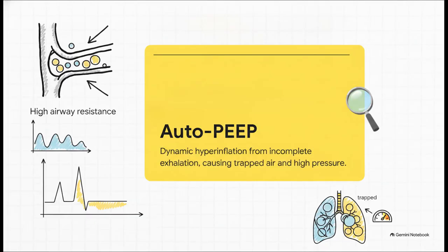And that case really highlights exactly why understanding the underlying disease is so vital. In obstructive diseases like COPD and asthma, airway resistance is off the charts. If you breathe for them too fast, they can't exhale fully. Air gets trapped beat after beat, leading to dangerous dynamic hyperinflation, which we call auto-PEEP. To prevent this, we deliberately use lower respiratory rates and smaller tidal volumes just to maximize their expiratory time.